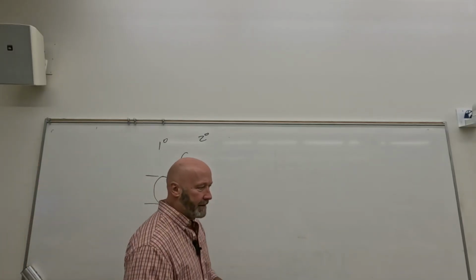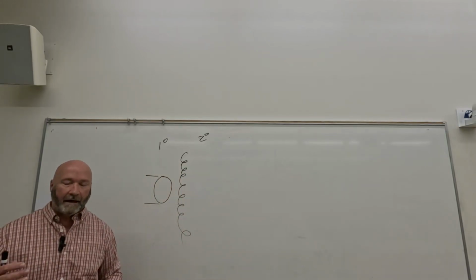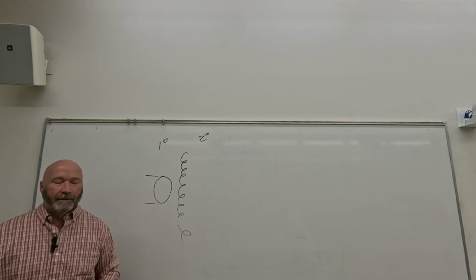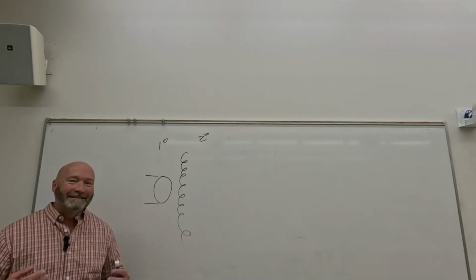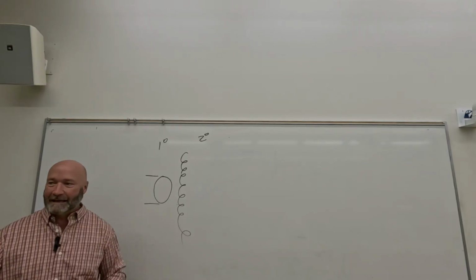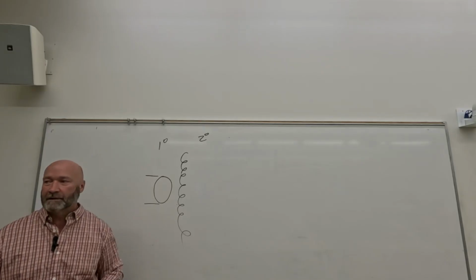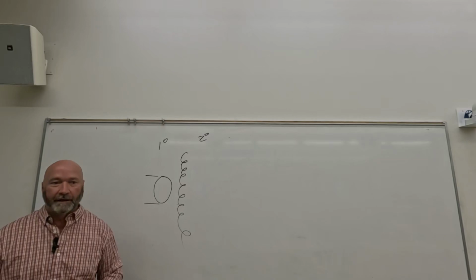So has Amy gone through technique and talked about how much of a change in voltage or amperage you have to have in order to see a visible difference in the image? Does that sound familiar at all? Yeah? Okay. So the general rule is the baseline, just to see any kind of difference at all, or to affect a change at all, the minimum change you would have to make in amperage is 30%.